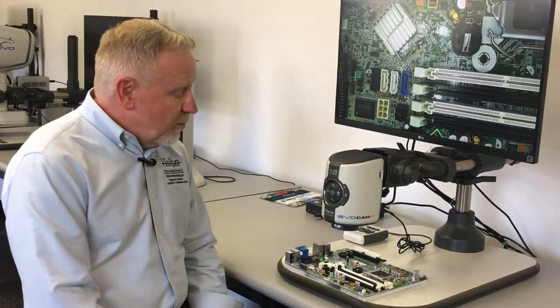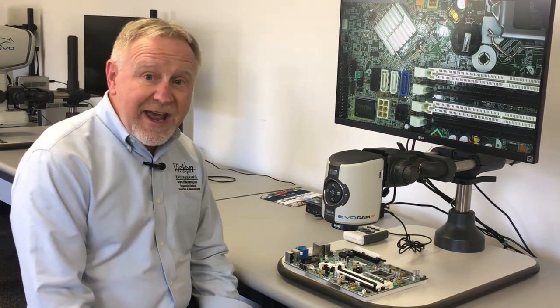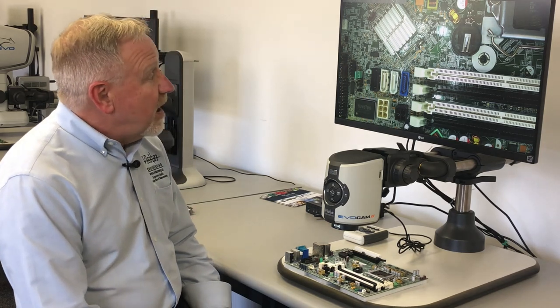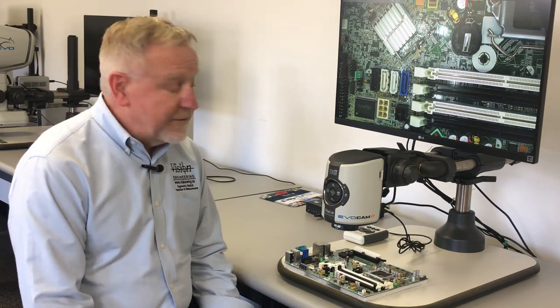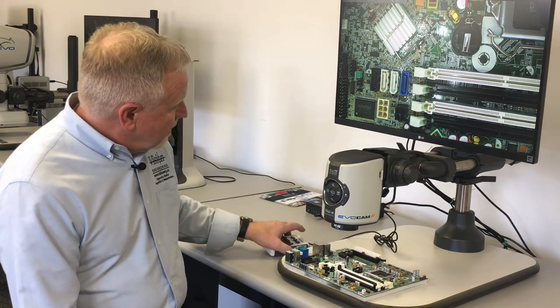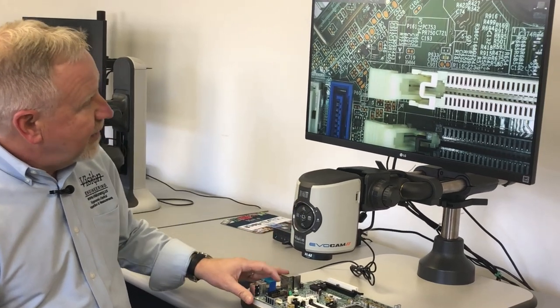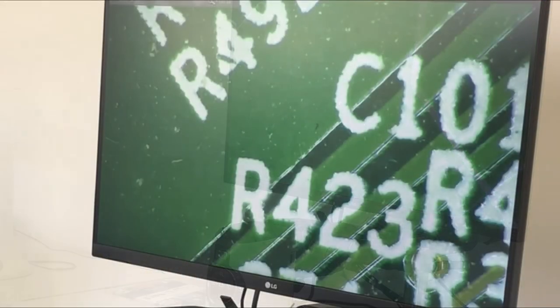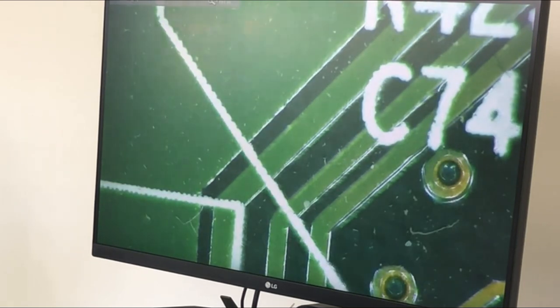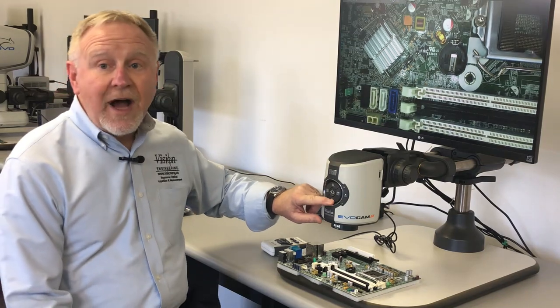The setup we're looking at now is using a .62 objective, giving a working distance in excess of 5 inches and a field of view that is over 6 inches at minimum magnification, with a top end magnification in an optical range of over 100 times. We can adjust the magnification through the controls right on the camera head itself, with fully auto focusing. That top end magnification is still within the optical range.